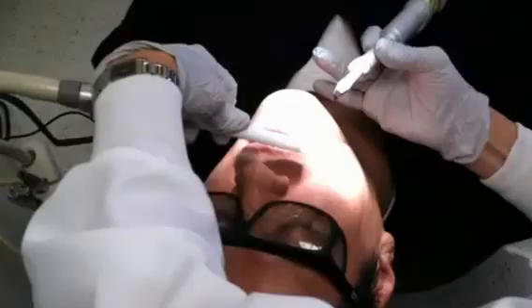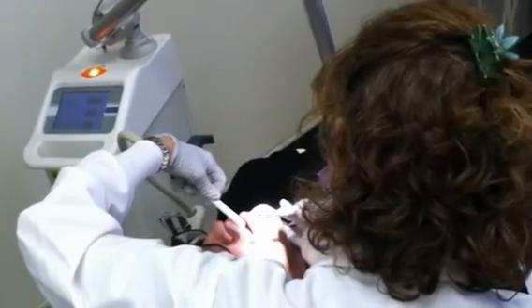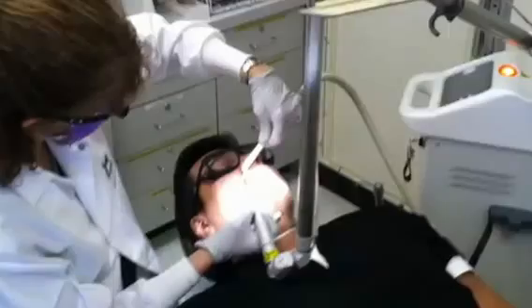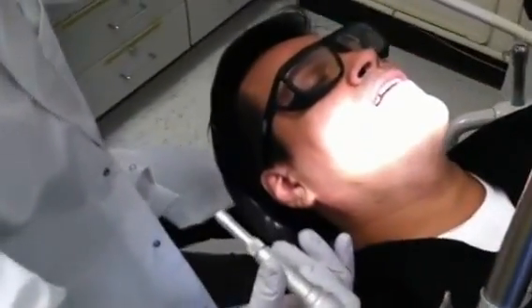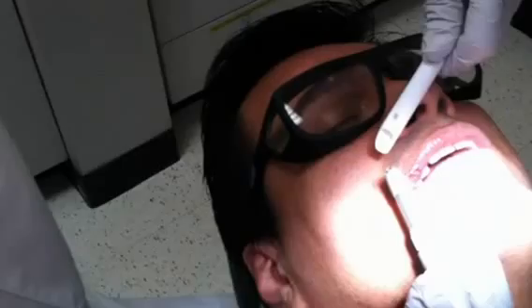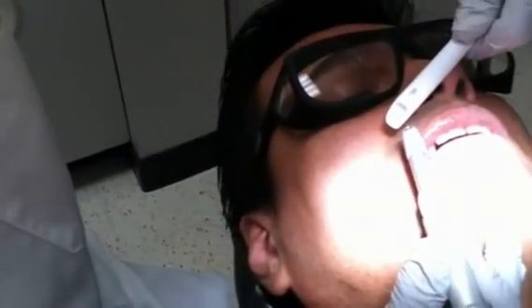Tell me when. Now I'm going to come in really close, and it'll be thick — like that, okay? That didn't hurt quite a little bit. Now I'm just going to do one little blister at a time. You doing okay? Yeah. So we're drying up those vesicles — kind of pops the blisters.